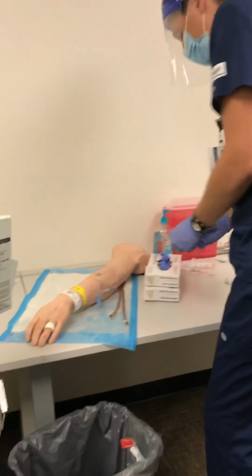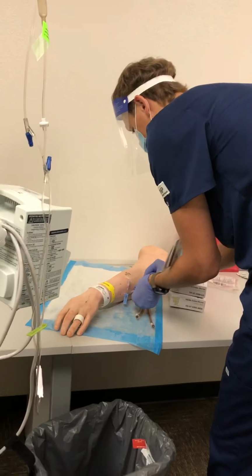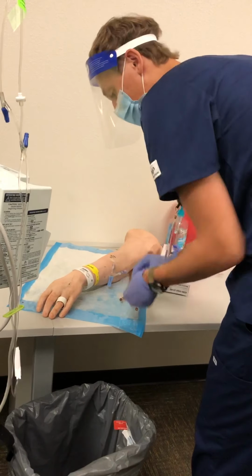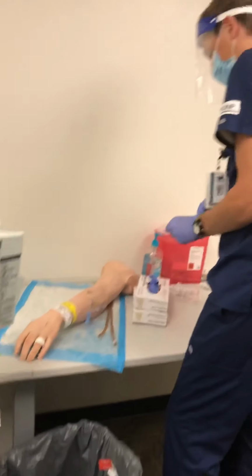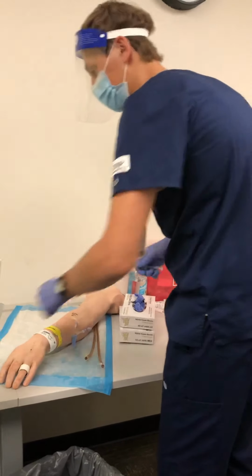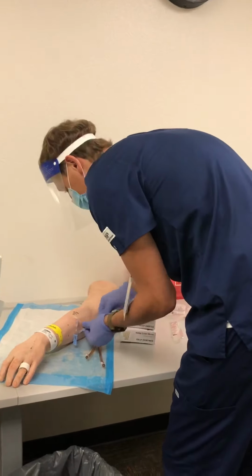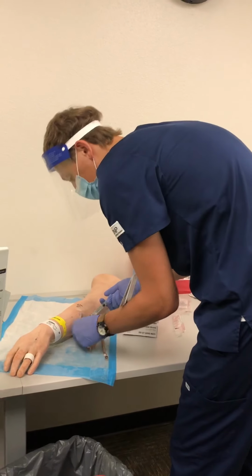I can then clean the hub one last time before I flush with the saline flush to make sure that all the medication has been instilled. Make sure to unlock this.